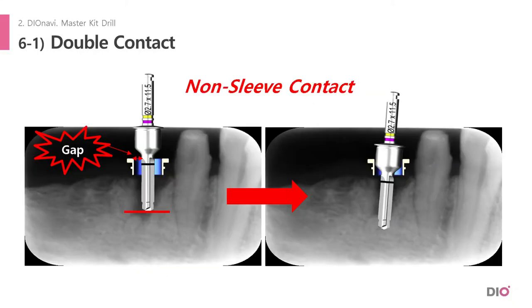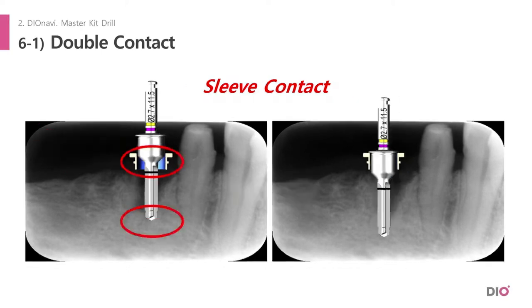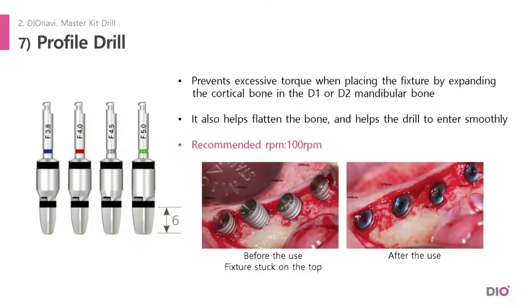This is a case where the drill didn't contact the sleeve. If you look at the picture on the left here, there's a gap between the sleeve and the drill. If you start drilling without double contact with the bone and sleeve, it will turn sideways like this picture on the right. However, if the contact is perfectly obtained from the top and the bottom, it can go in straight vertically like this picture.